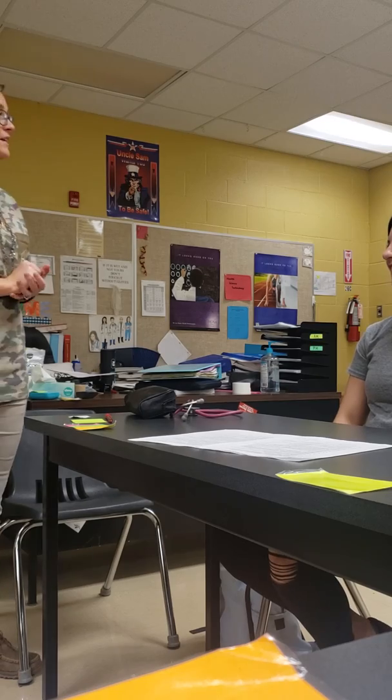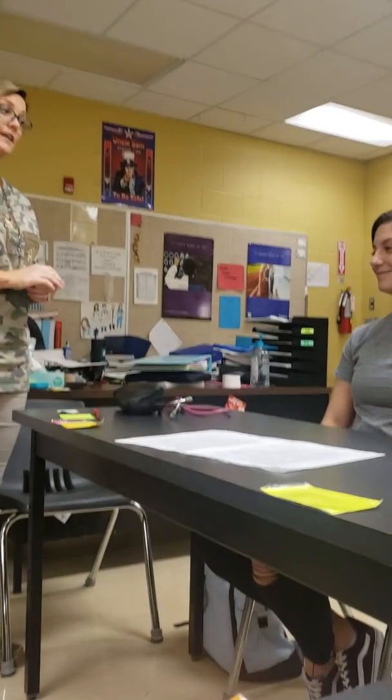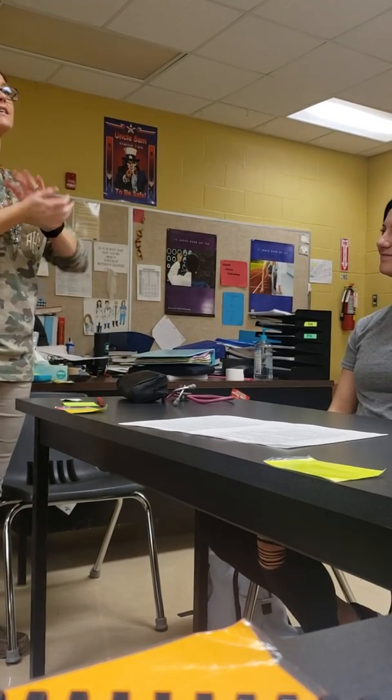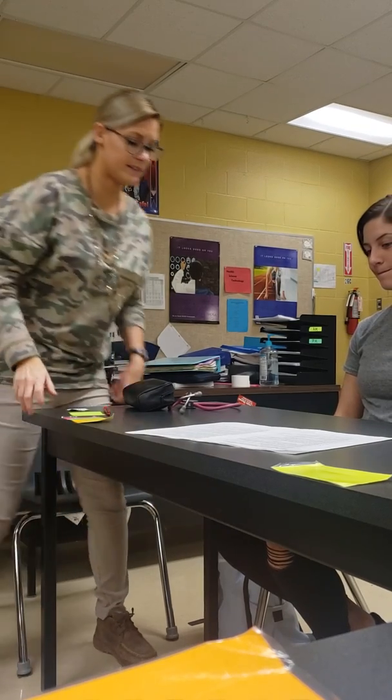Hello, Rachel. I'm Amy. I'm going to be your CNA today, and I'm going to be checking your vital signs. Is that okay? Mm-hmm. I'm going to wash my hands, and I'm going to provide for privacy. I'm pretending to close that curtain or shut the door, depending on where I'm at.